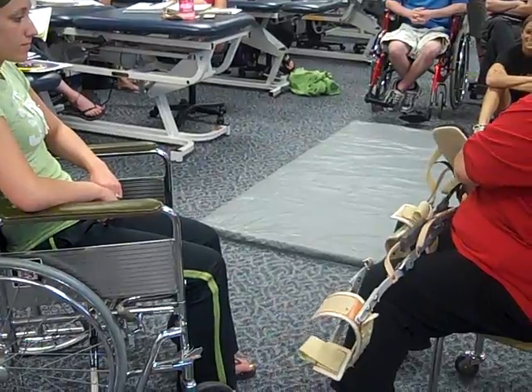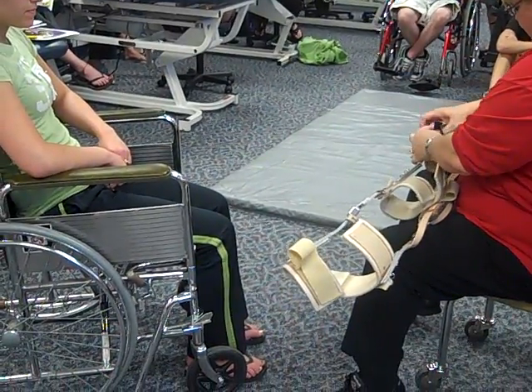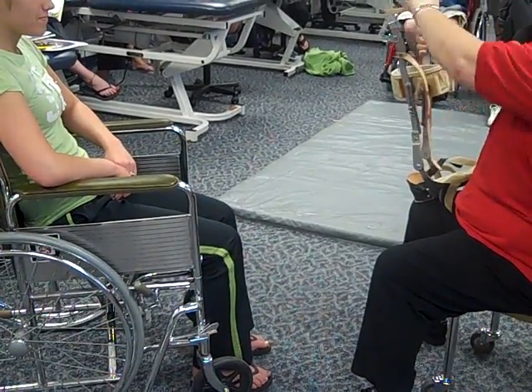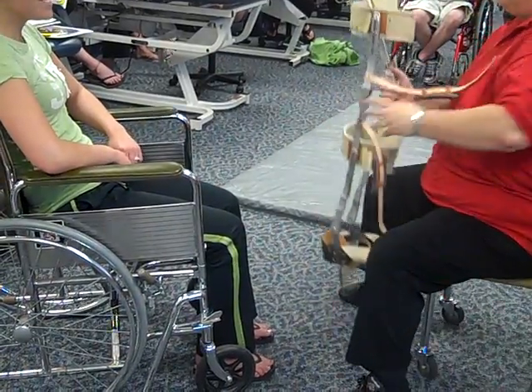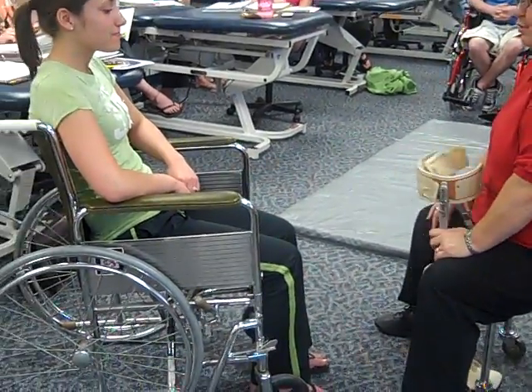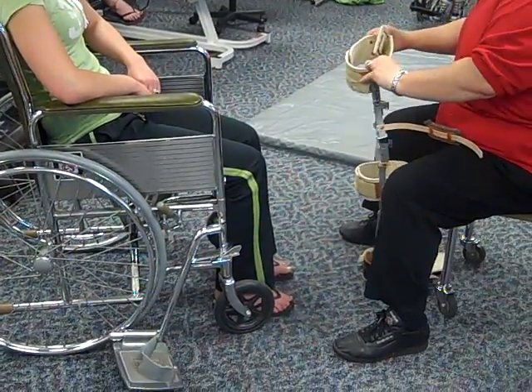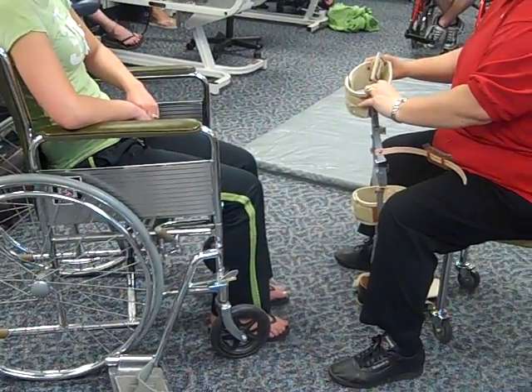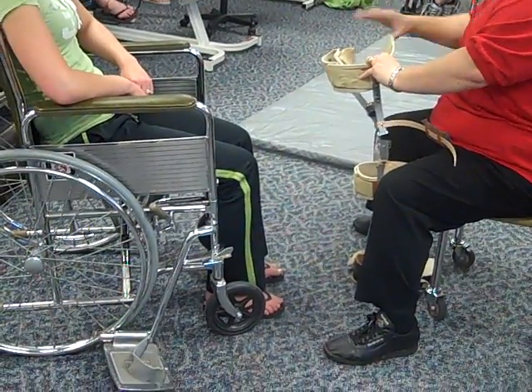So this is a patient with paraplegia, and we're getting ready to put her into this so that we can get her up into a standing position. We're going to say this is her first day with her braces, and we're going to fit the braces to her — they finally came. My name is BJ Simmons and I'm from physical therapy. I'm going to be trying these new braces on you; we had them ordered a couple weeks ago. I need to get them fit to you first. This might actually be a temporary one until the real ones come.